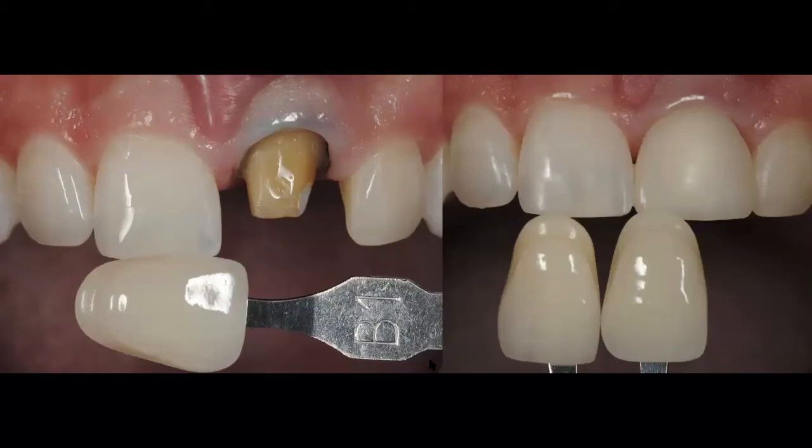So what I'm doing here is I'm taking a photo of my B1 shade tab located at the incisal edge, because what I'm trying to tell the lab is, in this middle portion of the tooth, where there is no effect of grays, whites, or yellows, just the middle portion where there is a solid color for the tooth, I want to know if this B1 shade tab matches here. And we can all agree that even though it's kind of close, it is not a perfect match. So the lab now understands that B1 is not as light as the patient's substrate, or the patient's shade on his natural teeth really is.